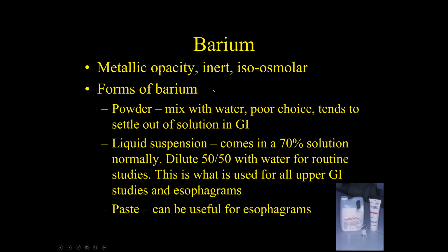Okay, so in the lower right corner, this is barium solution. Barium is a metallic opacity, you know, the 5 radiographic opacities, and barium is metallic. Typically it's bright white. It comes as a solution like this, in a gallon jug. It's a thick solution, kind of a pancake syrup consistency.